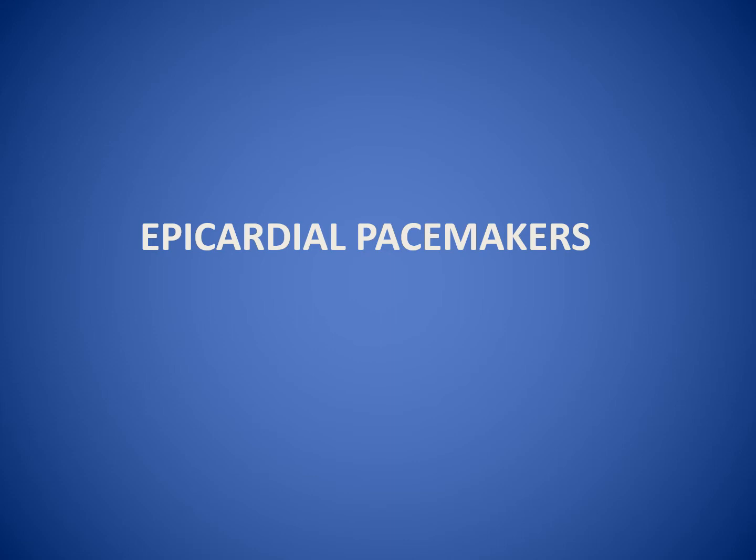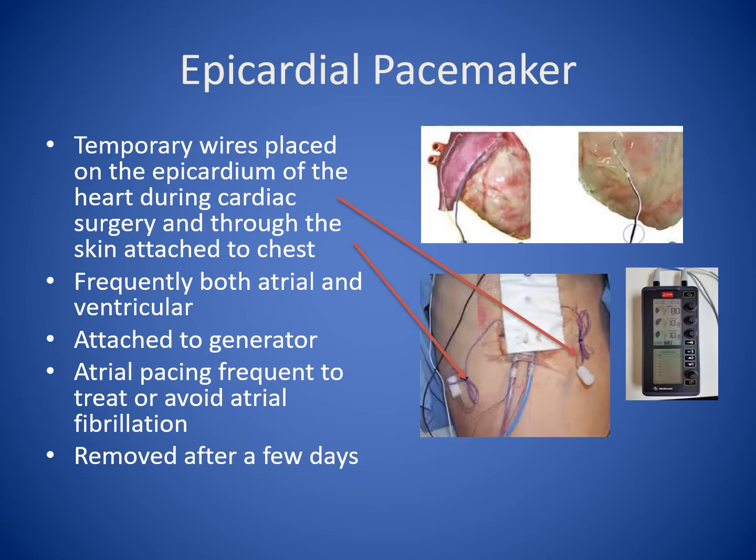The epicardial pacemakers, these are temporary wires that are placed on the outside of the heart. So that's your epicardium. Usually it's done during cardiac surgery and through the skin and attached to the chest, as you can see by the pictures. You will see frequently both their atrial and ventricles are being paced.